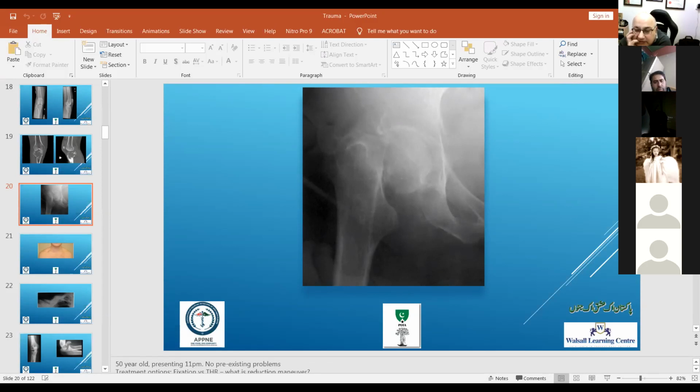It's a neck of femur fracture, and it looks like an acetabular fracture too, I think. Yeah, okay. Don't worry about these things. This is just an incidental finding. Okay, so fine. This is an AP X-ray of a skeletally mature person with an intracapsular neck of femur fracture.